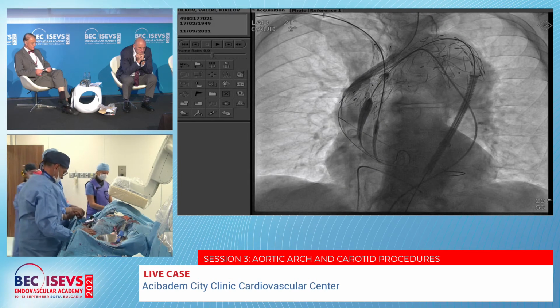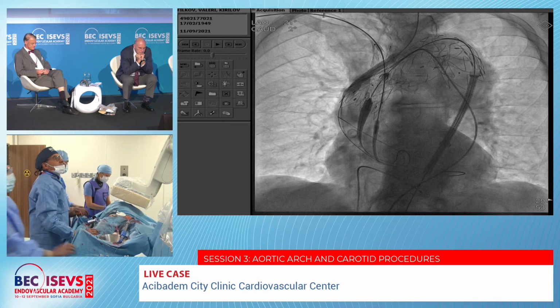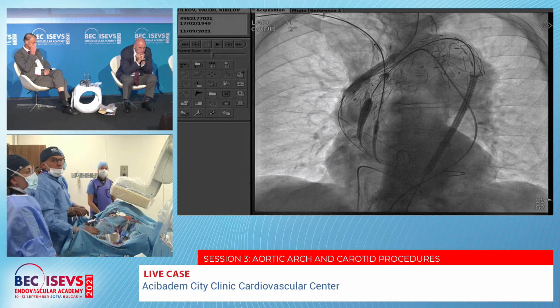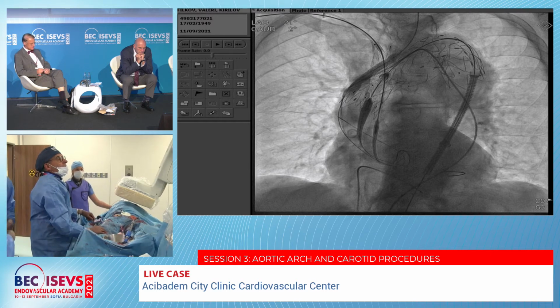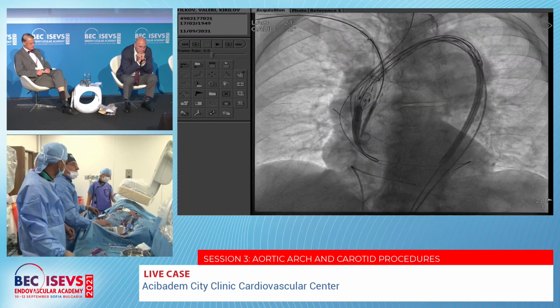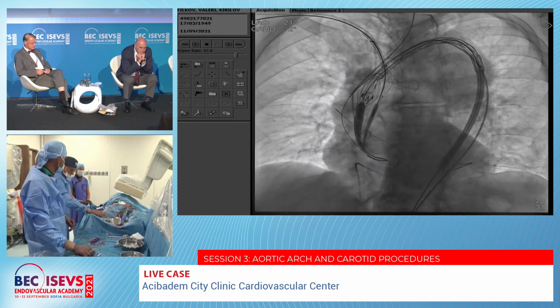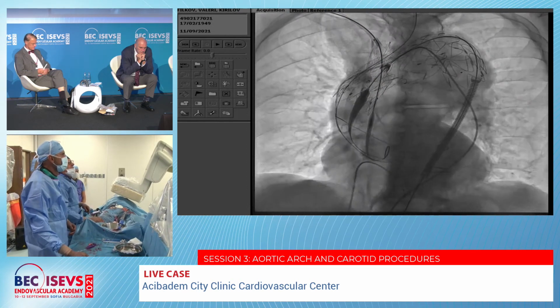Okay. Pace off. You probably saw, we can repeat that. Okay.